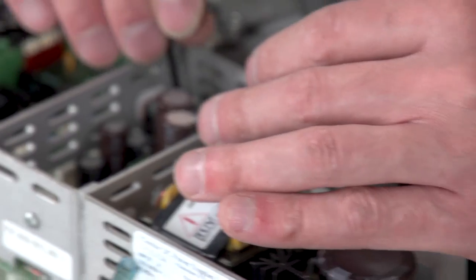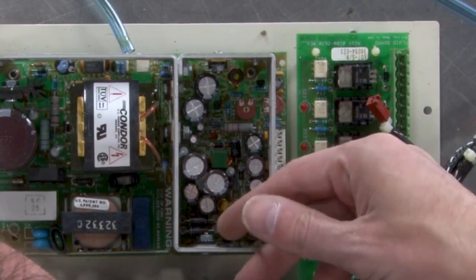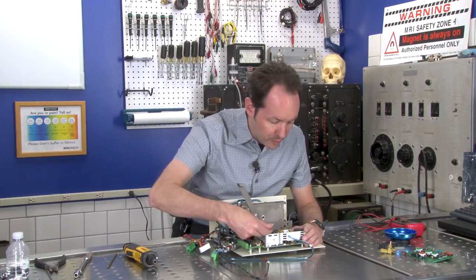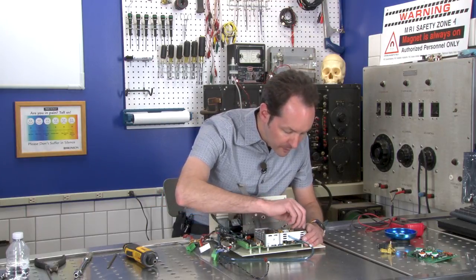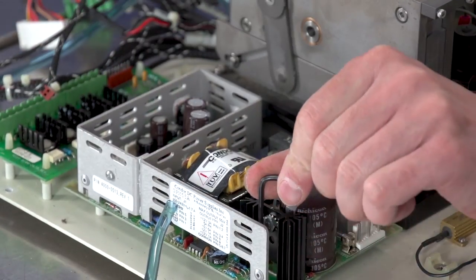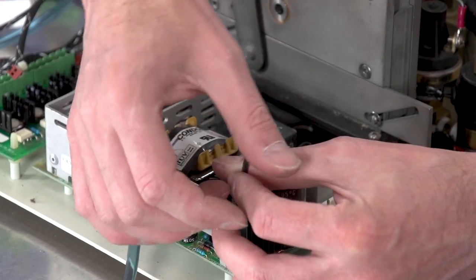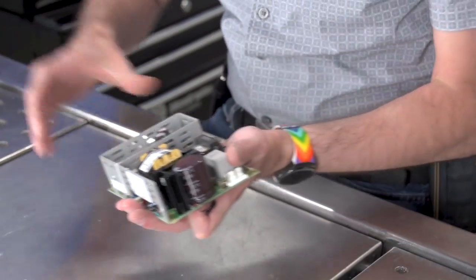This is a Condor brand power supply, I think. It's a nice one too — it's got a lot of adjustable bits. This Condor brand power supply was made in Oxnard, California, also the home of Haas CNC. And that comes right off.